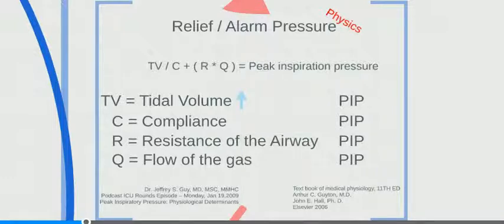All right, let's check this out. If we increase our tidal volume, say we go from 400 mLs to 500 mLs, what do you think that's going to do to the peak inspiration pressure? Just intuitively, what do you think it might do?